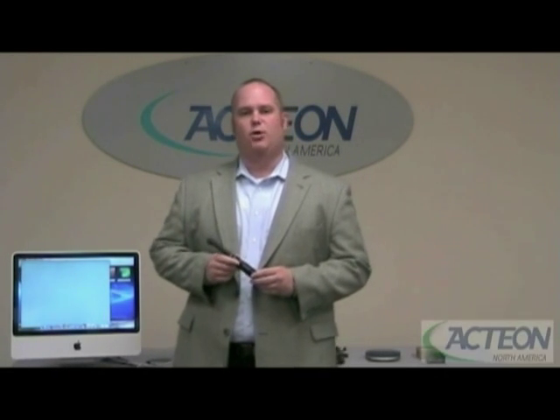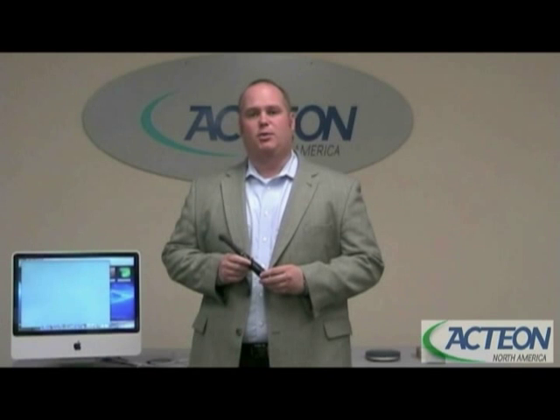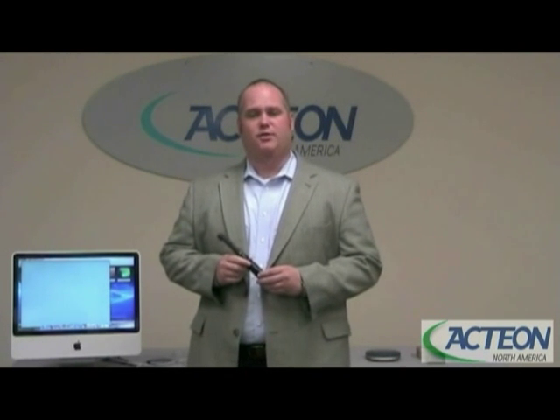Hi, I'm Tim Long with Acteon North America. Today, I'm going to talk to you about the SoProLife intra-oral camera and caries detection device.